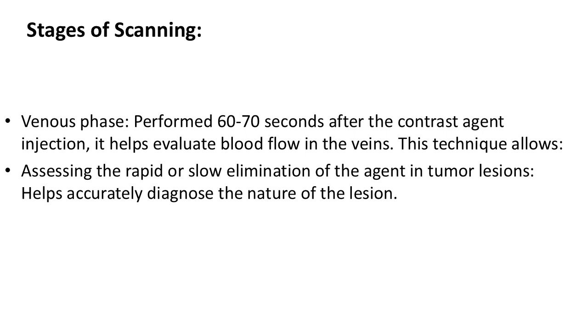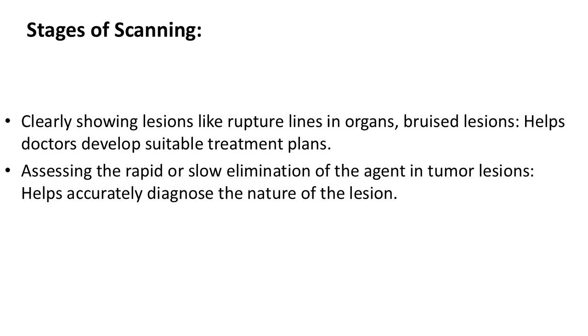Stages of scanning: venous phase performed 60 to 70 seconds after the contrast agent injection. It helps evaluate blood flow in the veins. This technique allows assessing the rapid or slow elimination of the agent in tumor lesions, helps accurately diagnose the nature of the lesion, and clearly shows lesions like rupture lines in organs and bruised lesions, helping doctors develop suitable treatment plans.